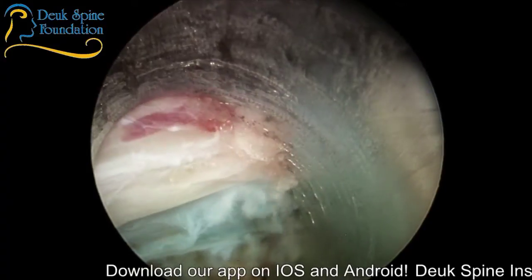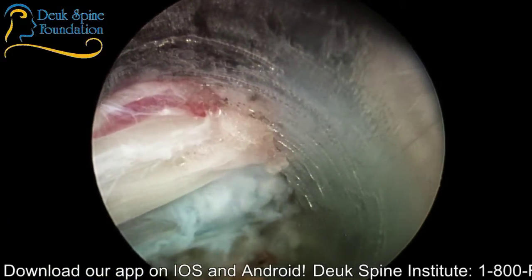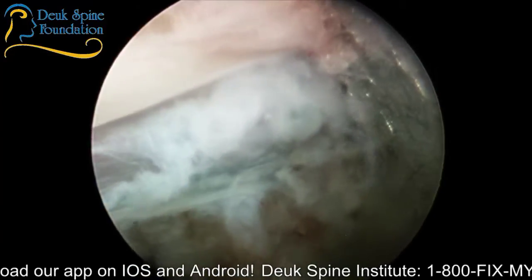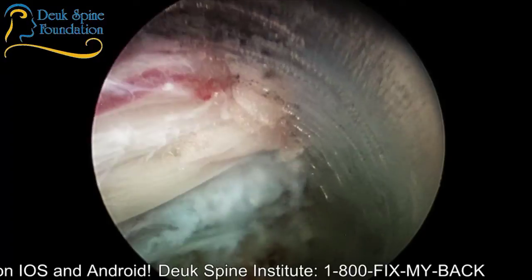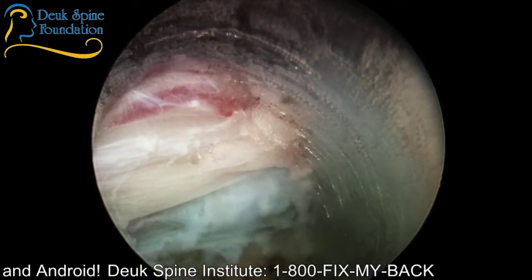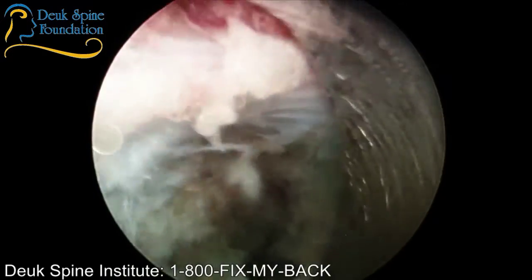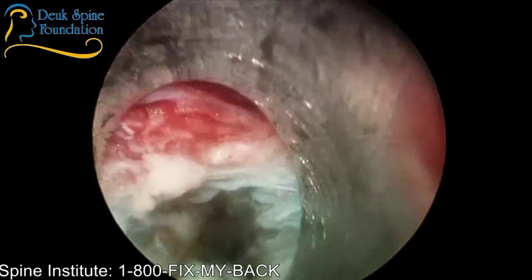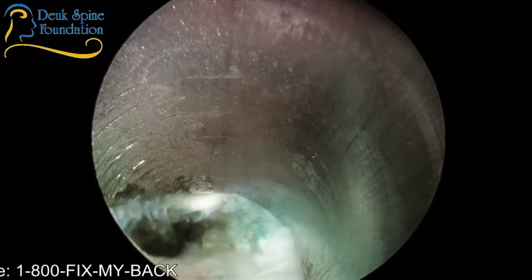All right, just real quick, what we're seeing at about 11 o'clock is the nerve root, but it's covered with fat, which is good. Remember, I told you her foramen were wide open, and that's the normal appearance of a nerve. It's covered in fat and veins. But you can see the herniation's gone. It was right there, just underneath the nerve root. I do want to clean that up a little bit, Luis, right there.